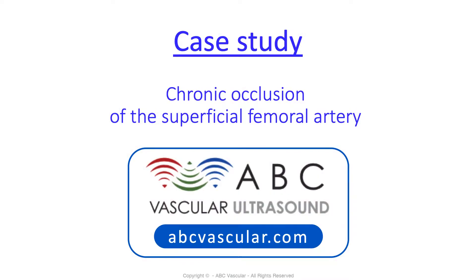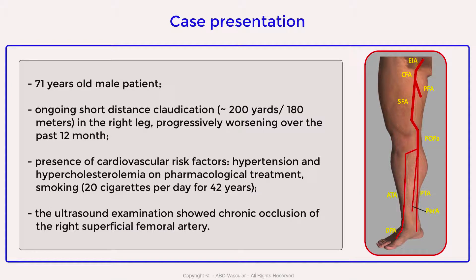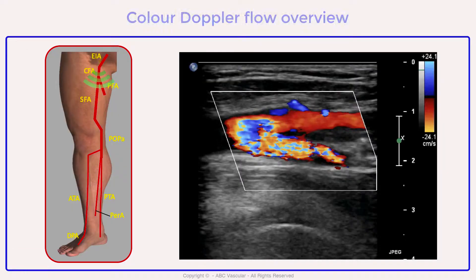Welcome to this ABC Vascular Ultrasound case study on chronic occlusion of the superficial femoral artery. This is a case of a 71-year-old male patient with ongoing short-distance claudication, progressively worsening over the past 12 months. The ultrasound examination showed the presence of a segmental chronic occlusion of the mid superficial femoral artery.